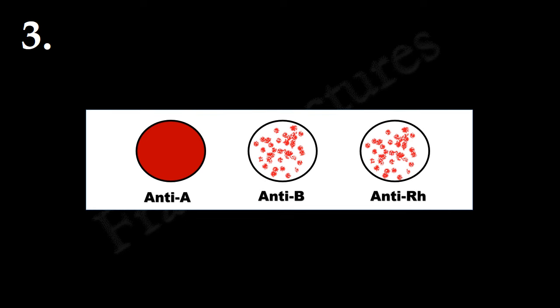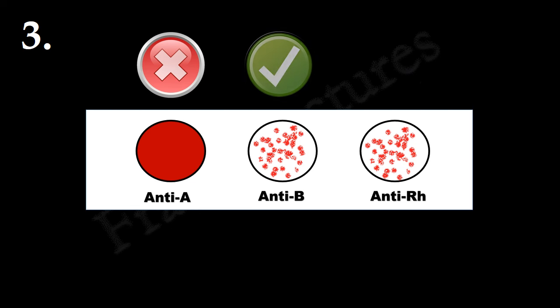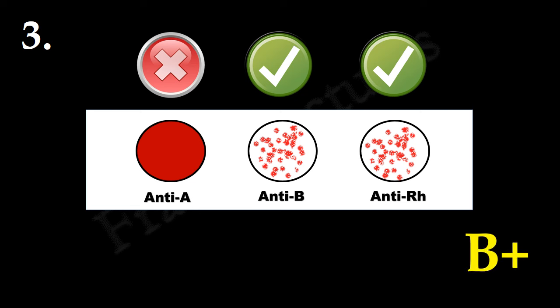Here, no agglutination in the anti-A circle, so antigen A is absent. B and RH antigens are present since agglutination is observed in the anti-B and anti-RH circles. So blood group will be B positive.